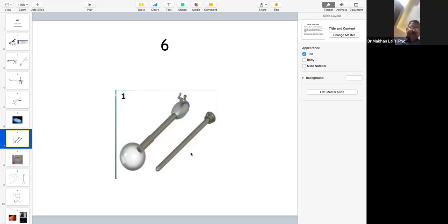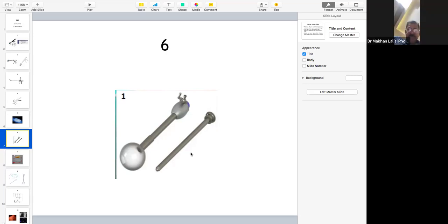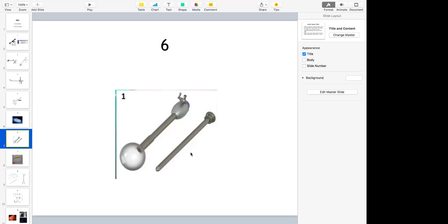Most of these can be autoclaved. That is one. Ethylene oxide, ETO. First of all, autoclave, as sir said, and ETO, because this is a metallic instrument without any perishable part. So you can do autoclaving. Next, the plasma sterilizer can be used. Plasma sterilizer or ethylene oxide. What is the problem with ethylene oxide sterilization?